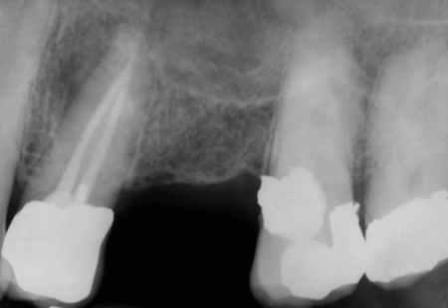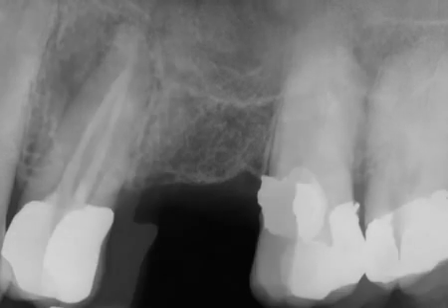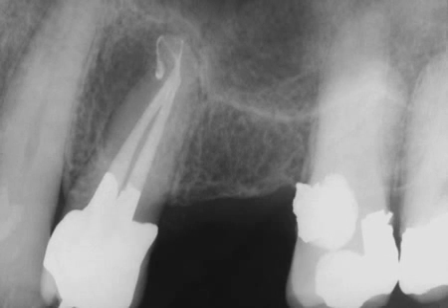This preoperative film of a maxillary bicuspid demonstrates a short fill and a large asymmetrical lesion of endodontic origin. After considerable time, I was unable to negotiate the canal. Because there was radiographic pathology and the patient had clinical symptoms, I gave myself permission to perforate, as the treatment alternative would have been surgery. A post-treatment film demonstrates I bisected the true canal apically and hydraulically packed both exits. In all cases, but in particular this case, a recall examination is important.